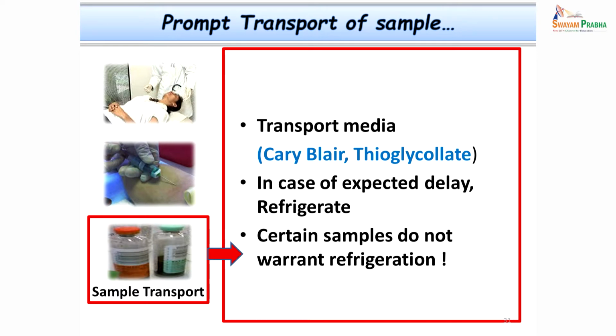Once the sample is collected, it has to be promptly transported. There are some transport media available, Cary-Blair, thioglycolate, etc.